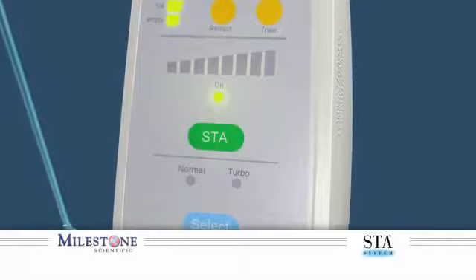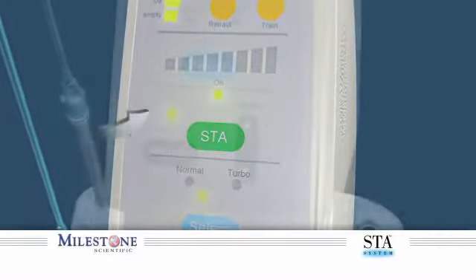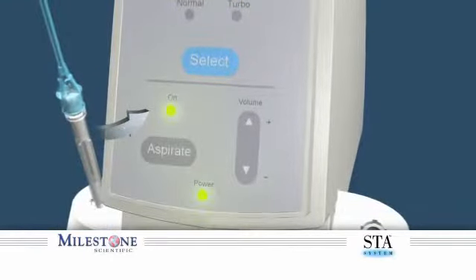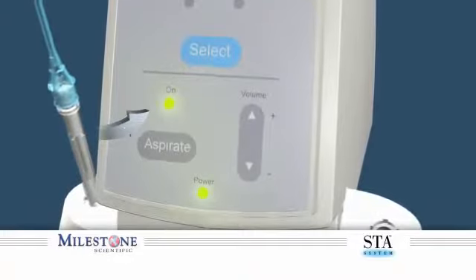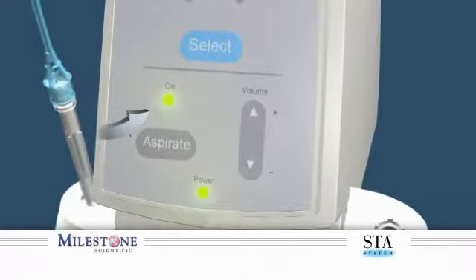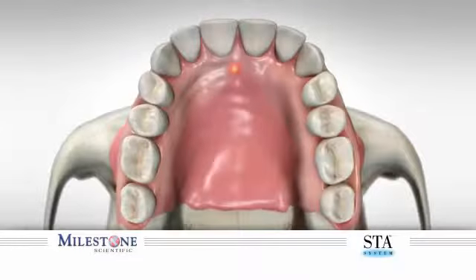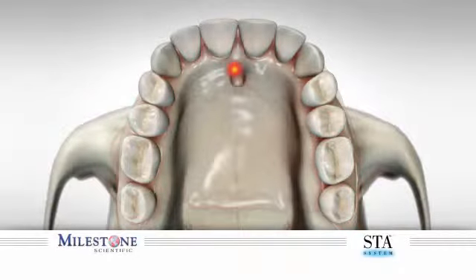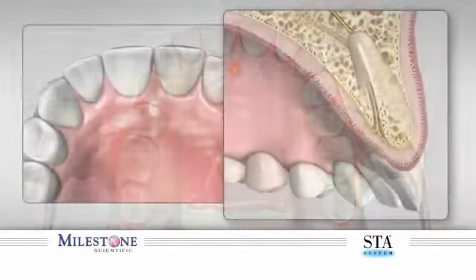Delivering the anesthetic at a faster rate than the control flow rate can result in adverse tissue reactions and/or tissue damage. Make certain the aspiration feature is on, as an aspiration test may be performed during the anesthetic delivery. Site of injection. This injection is initiated just lateral to the incisive papilla along the incisive groove, while targeting the underlying nasopalatine canal. The objective is to gain entrance into the canal and maintain contact with the inner surface of the bony wall of the incisive canal.